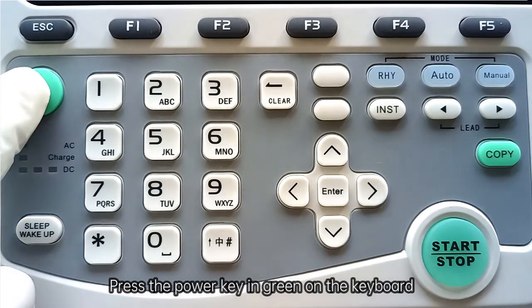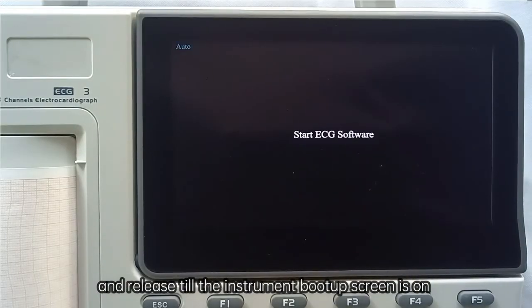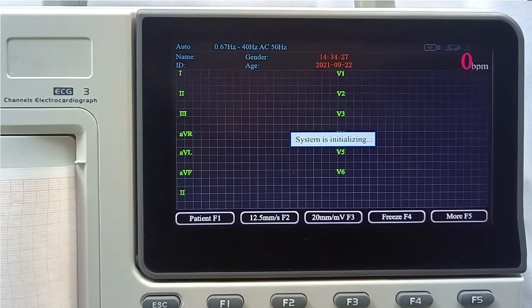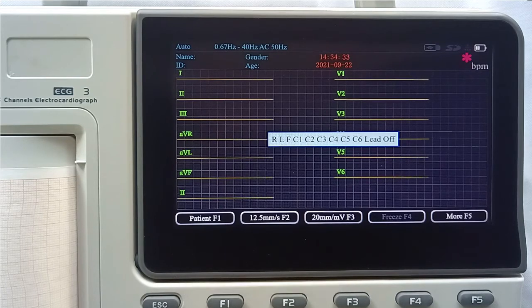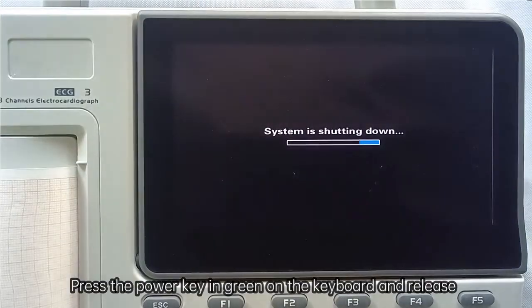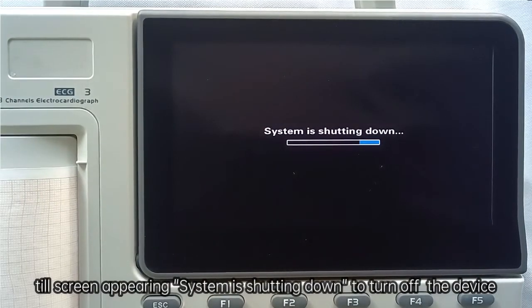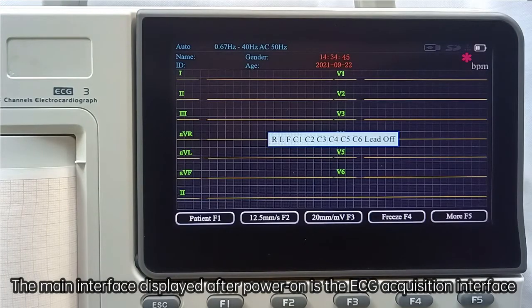To power on, press and hold the green power key on the keyboard and release it until the instrument boot-up screen appears. After entering the main interface, proceed to the next step. To power off, press and hold the green power key until the screen shows 'system is shutting down.' The main interface displayed after power-on is the ECG acquisition interface.